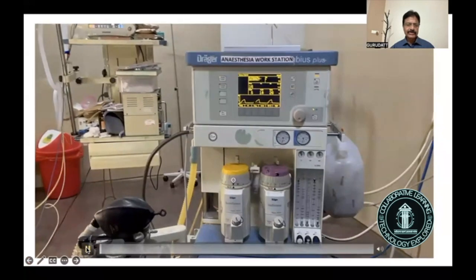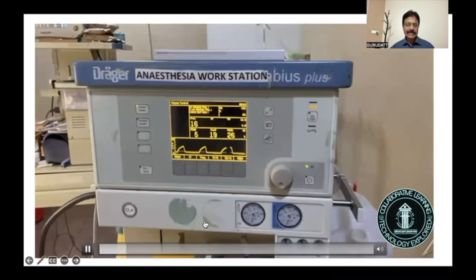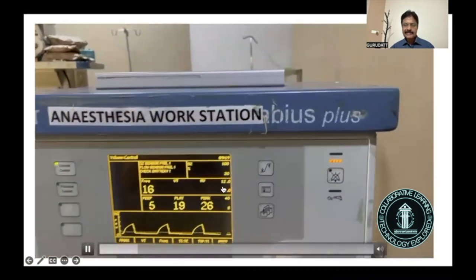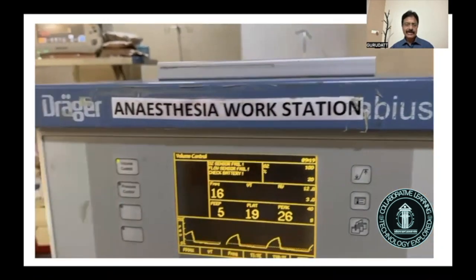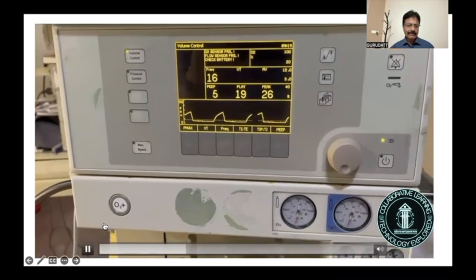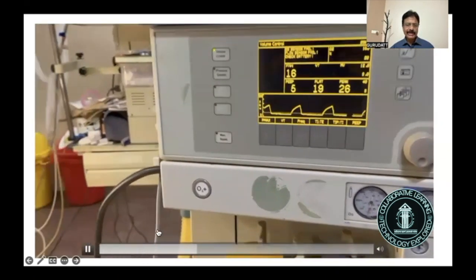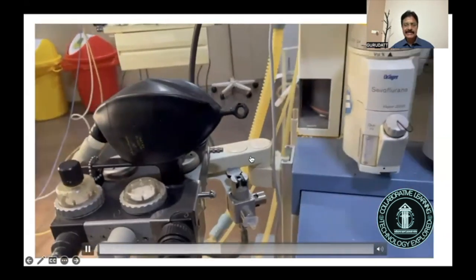Again, I want to show you how in the Draeger ventilator, the bag will be moving during inspiration and expiration, because it is included within the circuit, and it also has the fresh gas flow decoupling valve. So once again, you can see the bag movement during inspiration and expiration.